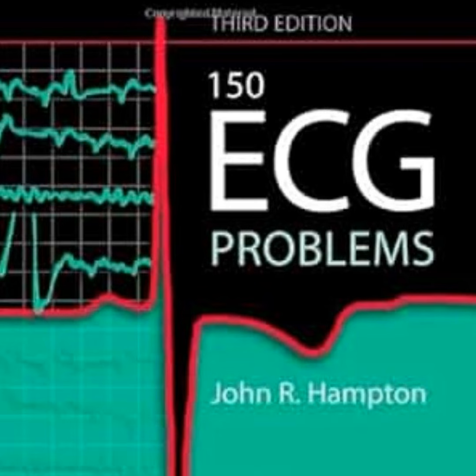Because the troponins give you that biochemical proof. Right. Like proof of myocardial necrosis, way before the electrical vectors have time to catch up and change. Exactly. It's kind of like trying to drive a car by only looking at the dashboard gauges and totally ignoring the windshield. That is a great analogy. Like you could look down and see you have a full tank of gas, the engine temp is fine, but you could literally still be driving off a cliff. Yeah, the ECG is essentially just a trailing indicator in that specific early window.